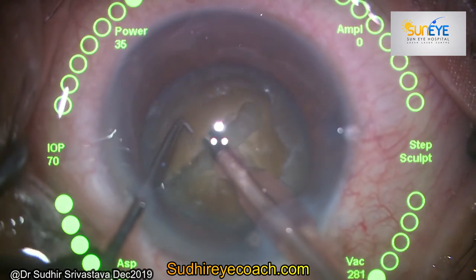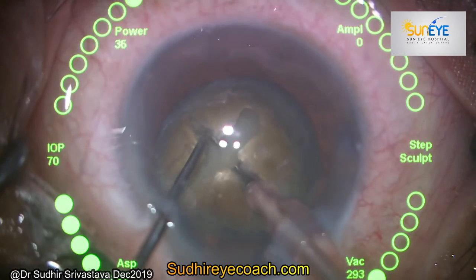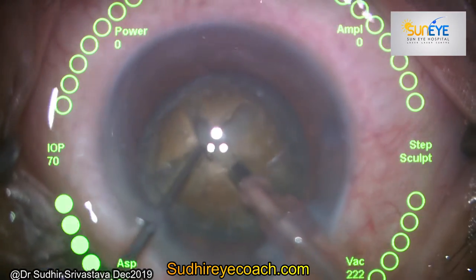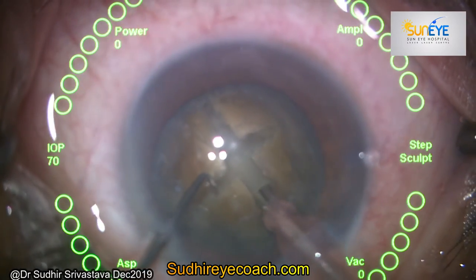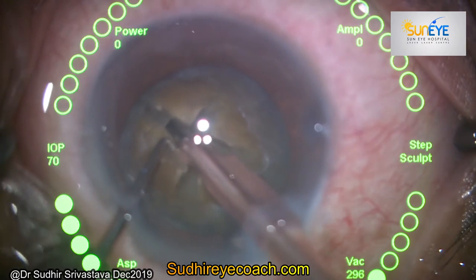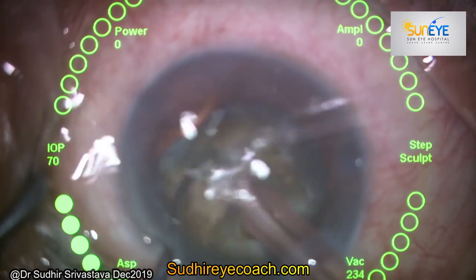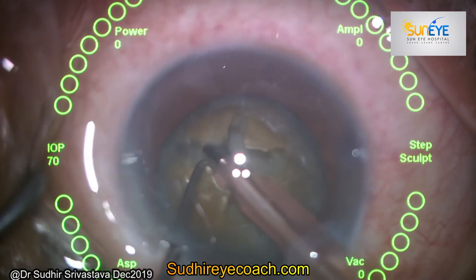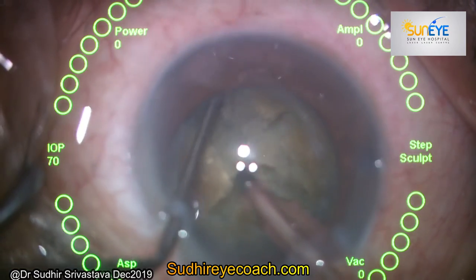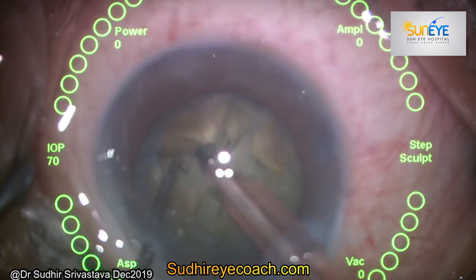Complete the plus sign and adjust the depth at places with lower power. If you are sure about the depth of the crater, place both instruments in the crater and try to split the nucleus in two pieces. As the name indicates — divide and conquer — perfect division is the key to success. Rotate the nucleus again, place both instruments in the crater, and split the nucleus.